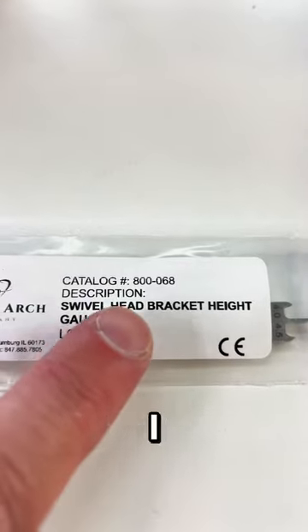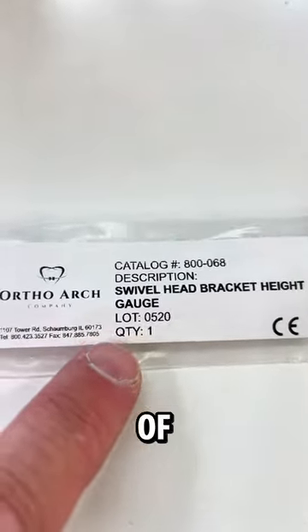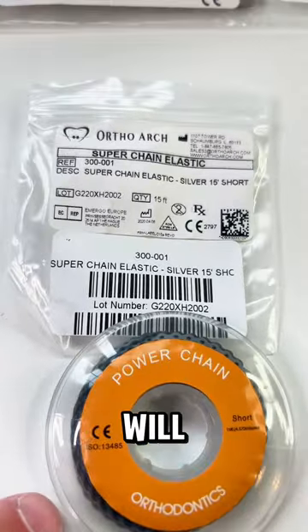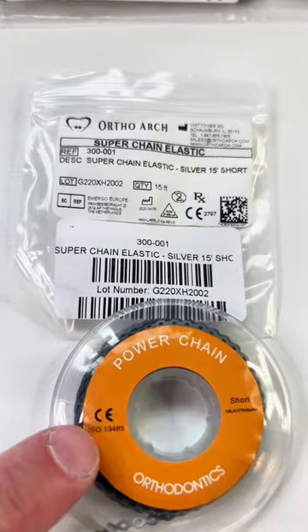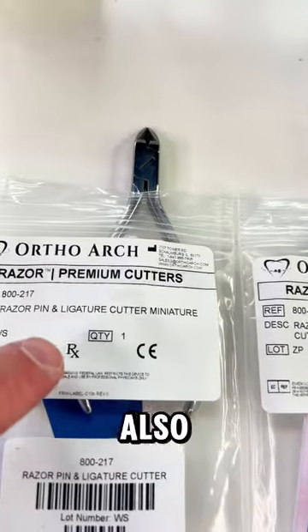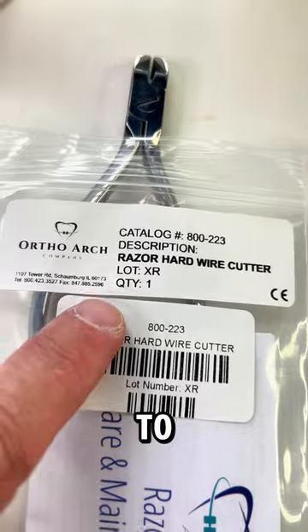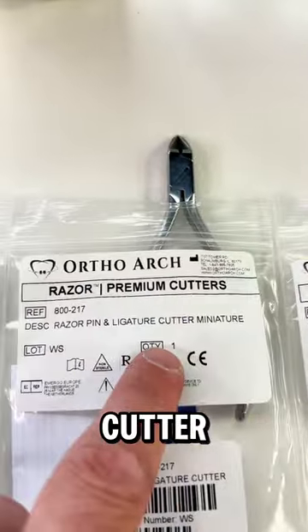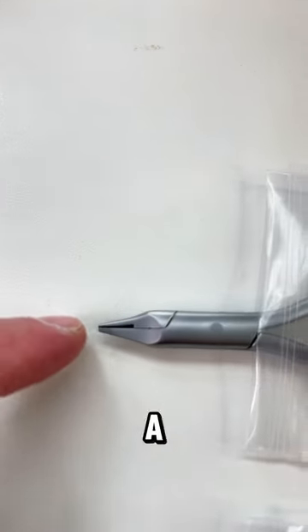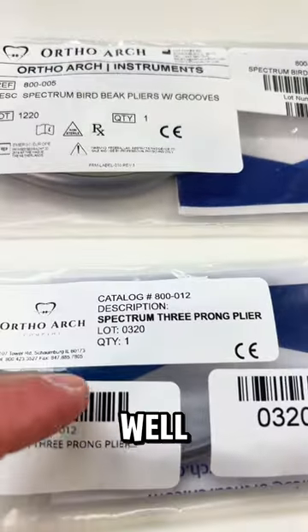You will also need a bracket height gauge. I really like the swivel head type — it has two ends with different measurements on one instrument. You just need one swivel-head bracket height gauge. You'll also need some power chain — any color will do, for the typodont exercise and for patients. For cutting instruments, you'll need a distal end cutter that holds the wire, a pin and ligature cutter, and a heavy wire cutter. Finally, you'll need a bird beak plier and a three-prong plier.